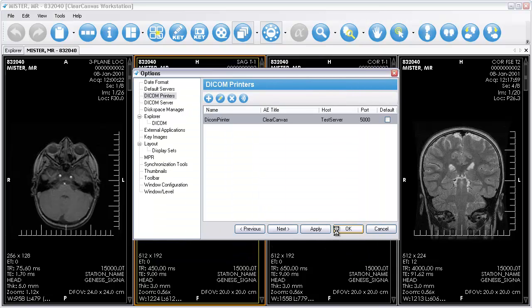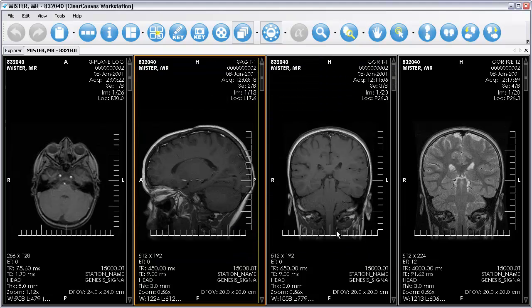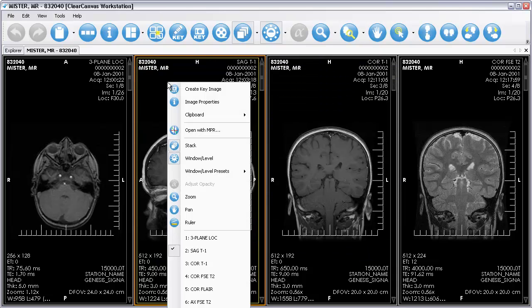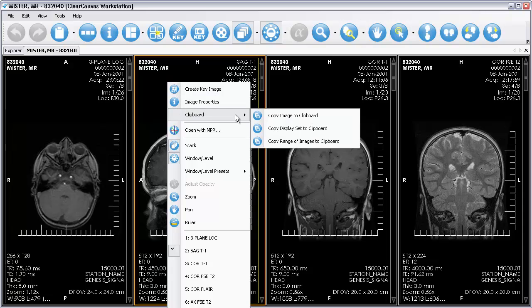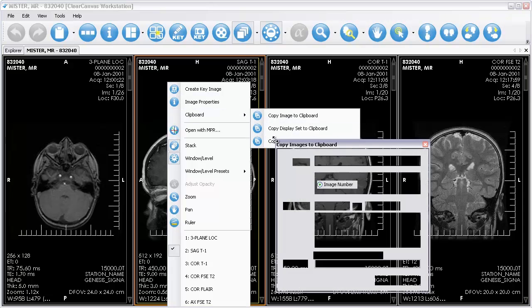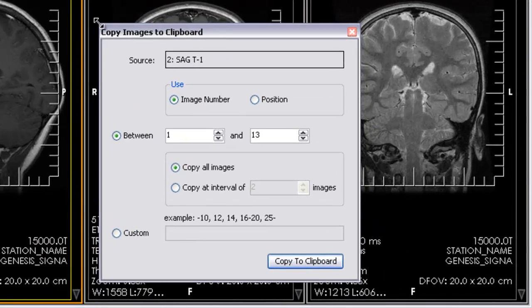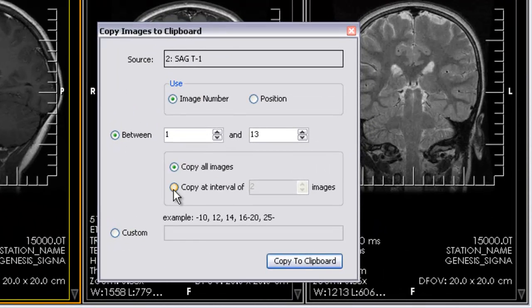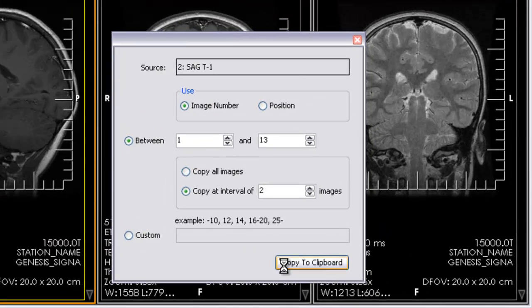In order to print an image, you need to copy it to the clipboard first. Right-click on an image, and select Clipboard, Copy range of images to clipboard. Select Copy at interval of two images to copy every other image to the clipboard.